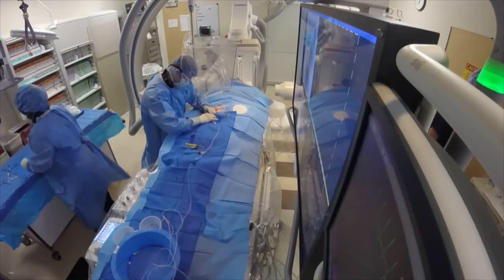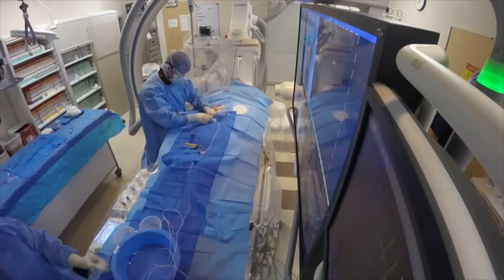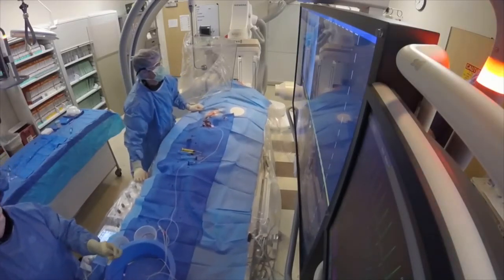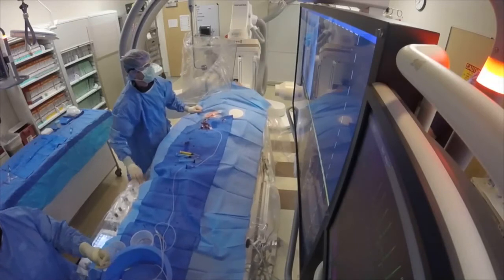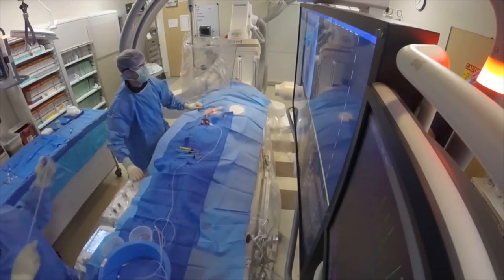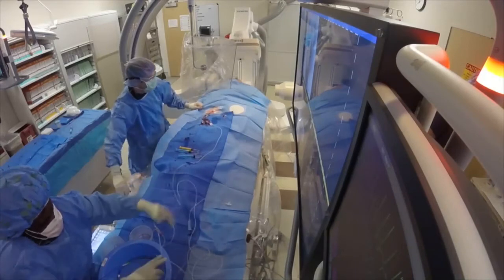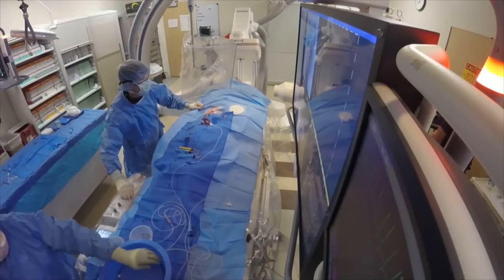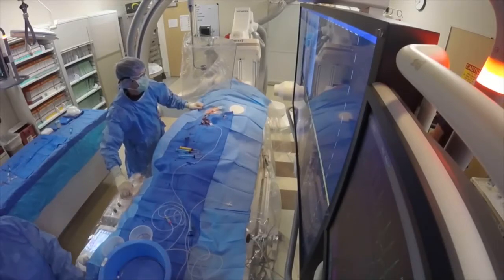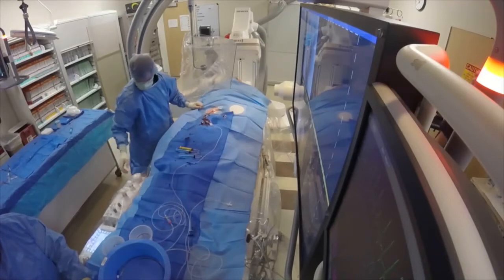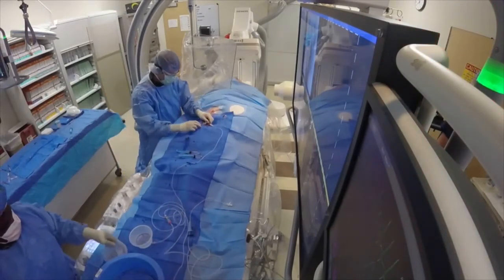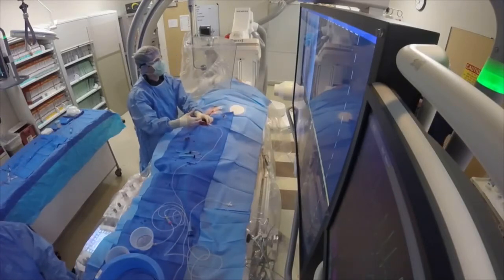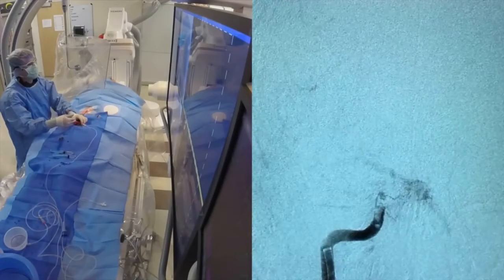Now we're navigating the catheter into the right internal carotid artery and injecting contrast as we're doing it. The inner catheter is staying stable and we're advancing the outer catheter over that inner catheter pretty far along the internal carotid artery. We've removed the inner catheter so now we just have one catheter acting as our guide catheter — the main catheter that stays in place and gives us a working channel to remove the clot through.